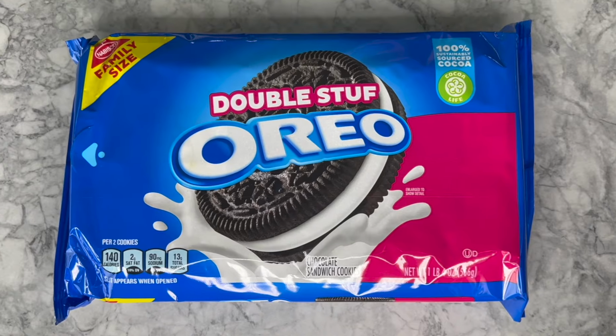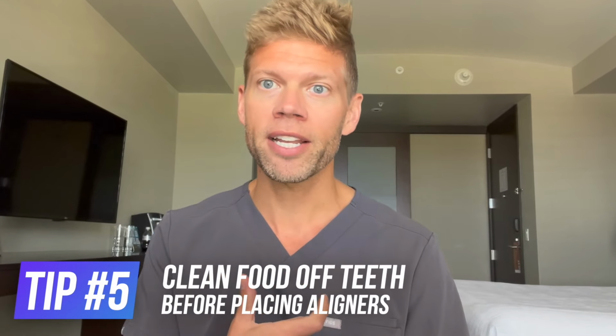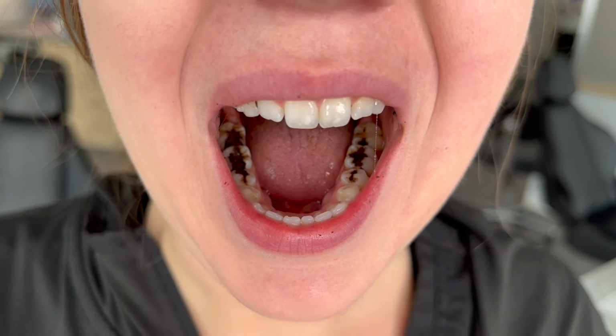Another tip is with food. So after you eat food, you should always clean your teeth before putting your aligners back in. If food gets trapped on a tooth, and then your aligners get seated over the top of it, it's holding the food against your tooth. Bacteria will eat that food up and create cavities on the tooth over time. So always make sure that you brush your teeth after eating, or at least wash your mouth out with some water before putting your aligners back in.